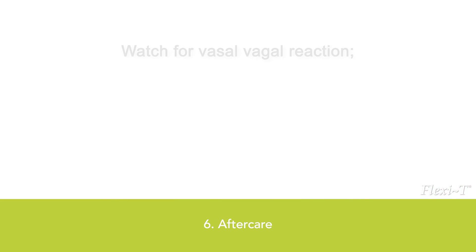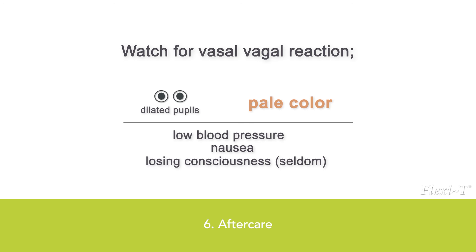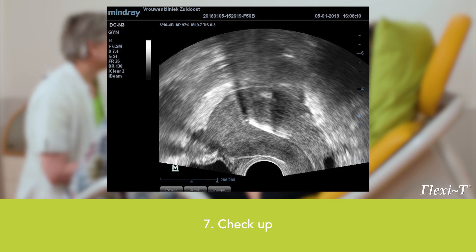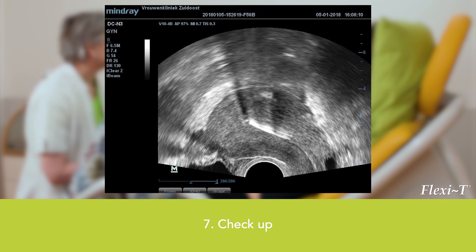Care after insertion: A vasovagal reaction may occur due to stimulation of the vagus nerve when dilating the internal orifice; this is more common in nulliparous women. Knowledge and control of the vasovagal reaction are necessary to properly monitor and assist the patient. A check-up should be performed after four to six weeks, and the presence and position of the Flexi-T should be verified at least after the first cycle and after approximately six months.